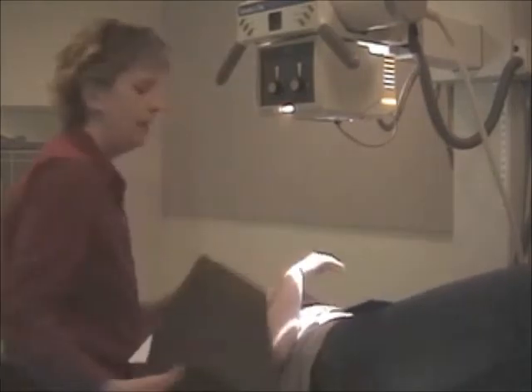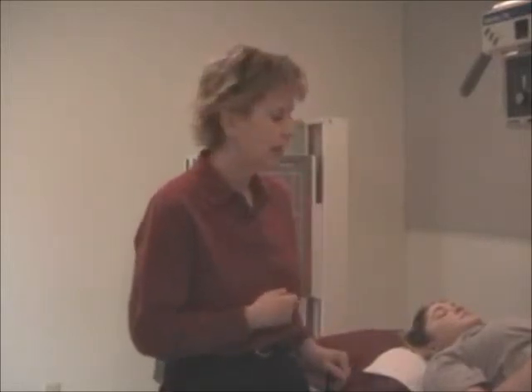Okay, we're going to let Kristen relax for a minute. If the patient was hypersthenic, you'd raise the central ray. You'd have to center higher. Hyposthenic, you center 1 inch below the reference, and asthenic 2 inches below the reference.